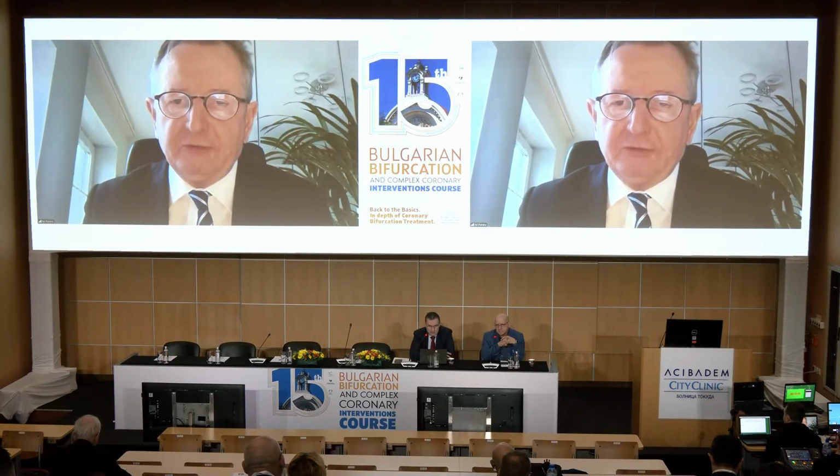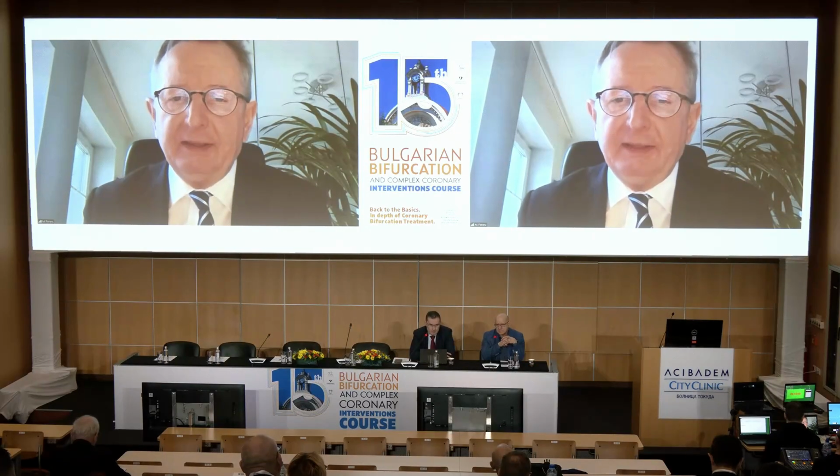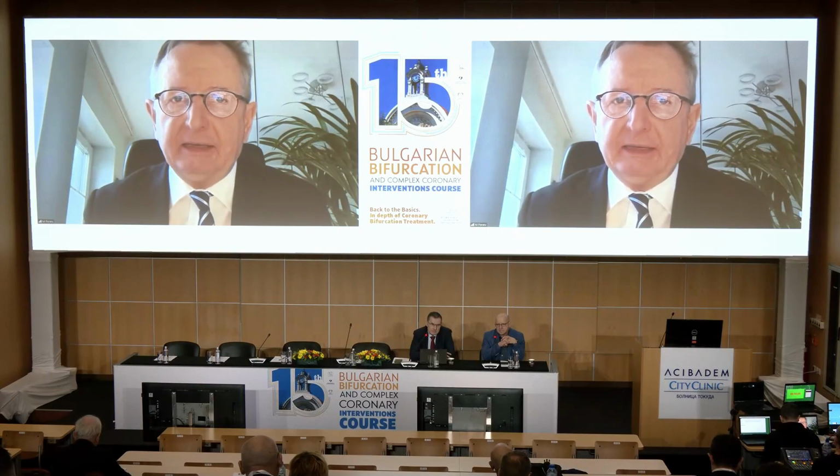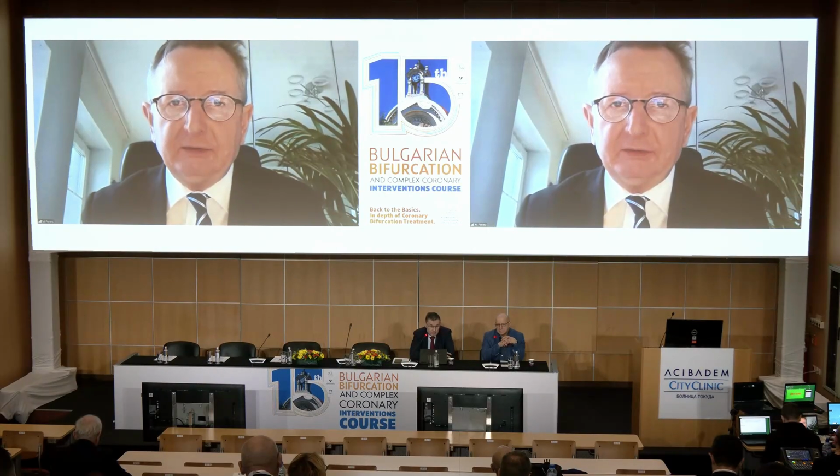Yes. We usually start with 1.5. This makes around 80% of cases, and in 15% on top we go with 1.75, sometimes 2.0. But 80% is 1.5, and we try to avoid 1.25.